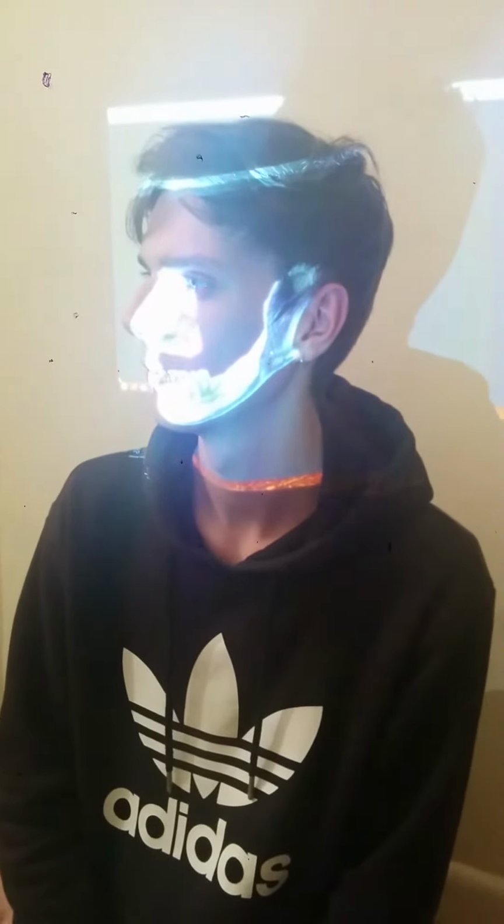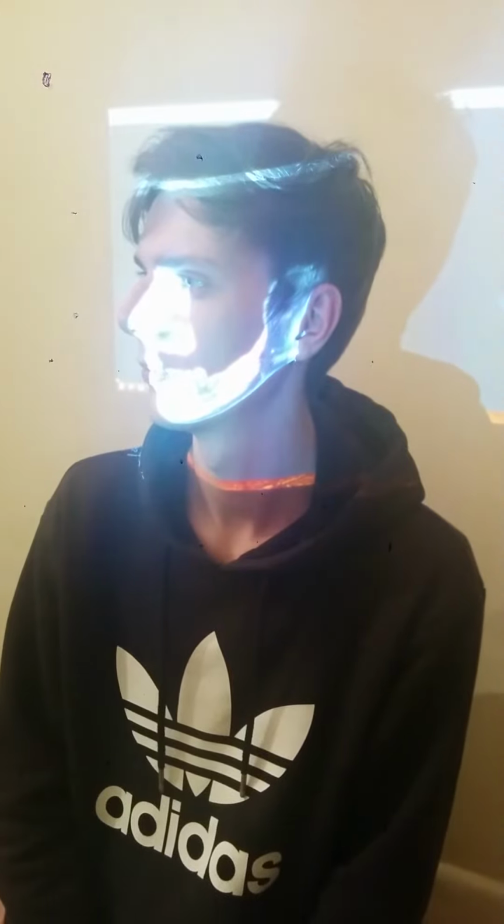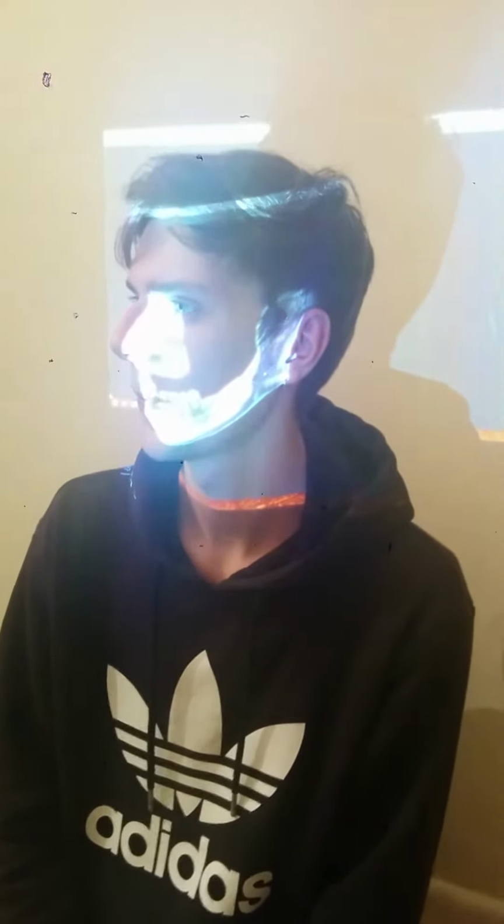Again, the picture is not in line with the patient, so you just move the patient. Can you move slightly closer this way? Perfect. And as you can see here, the STL file has now been placed very accurately onto the patient's face, corresponding to his rotation. There are certain situations when this system would not work.